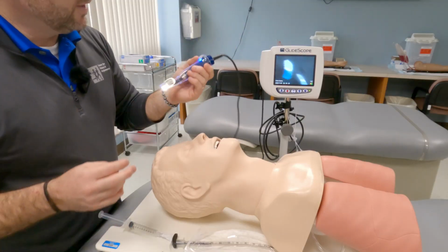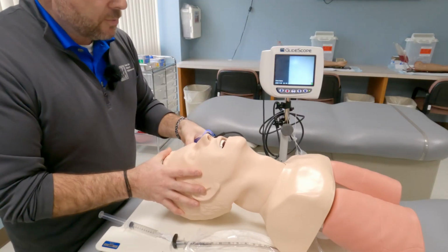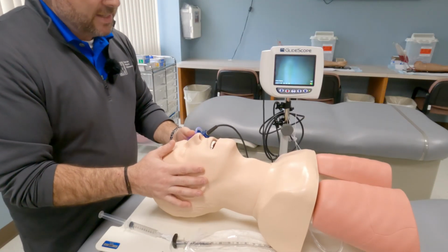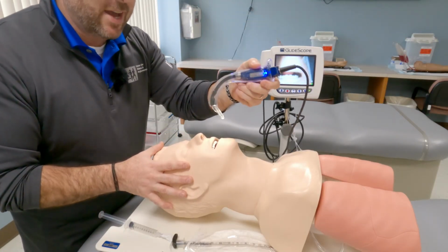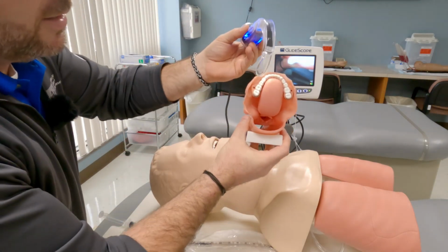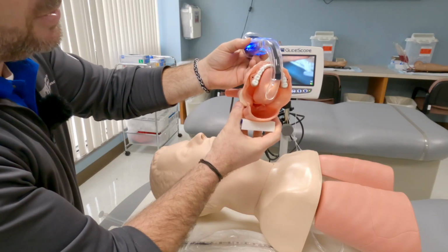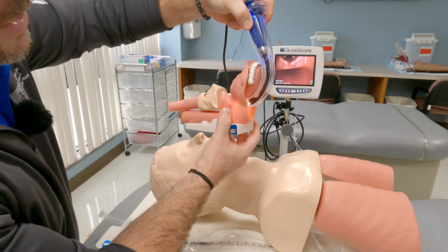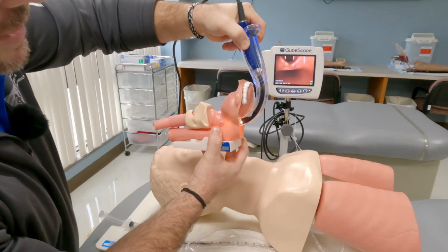Just like with intubating as we do direct, it's going to go in my left hand every time. If we were doing direct on this patient, we would probably start on the patient's right side and then kind of sweep a little bit. This is a lot different. This has to go straight down the center. And when it goes straight down the center, it's going to look something like this from this piece of equipment right here. It's going to slide straight down the center. And you see how it's nice with the curvature with the tongue. It kind of goes around the corner. And then it's going to act like a hook, and you're going to pull upward on it, so up this way, and it's going to lift that soft tissue up.